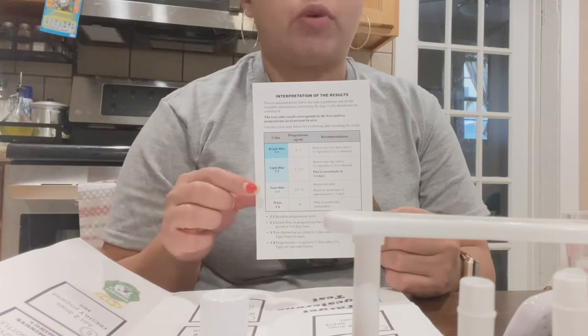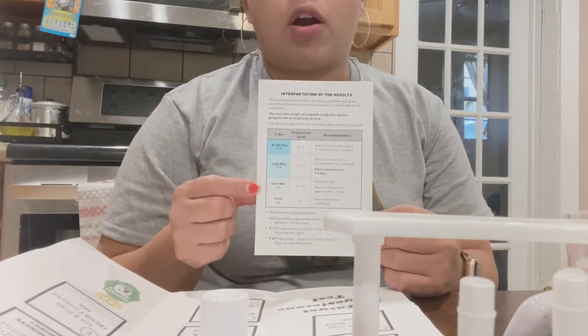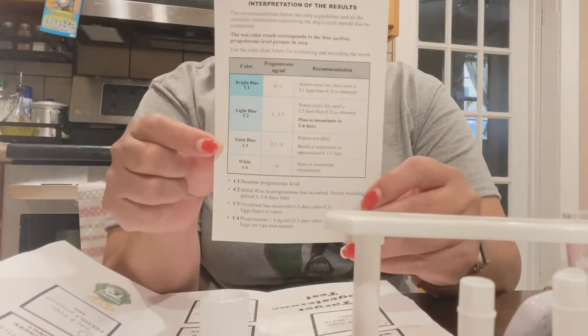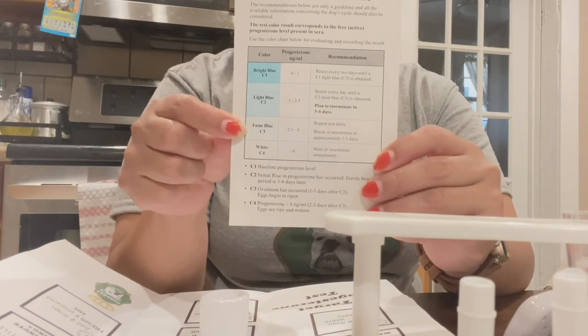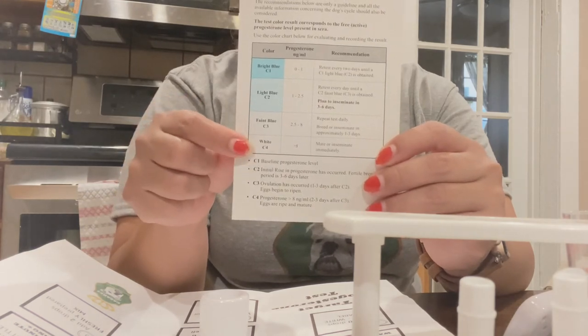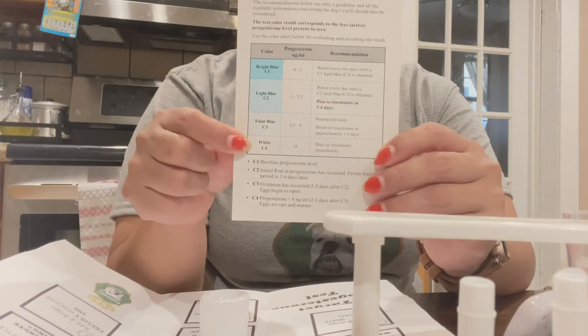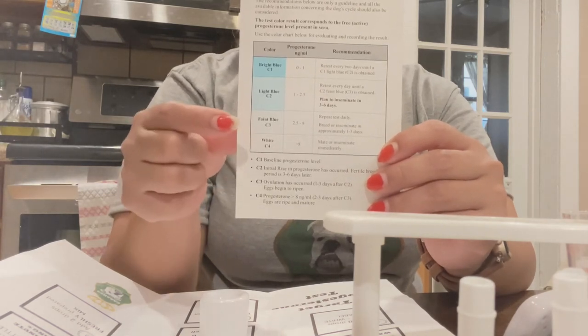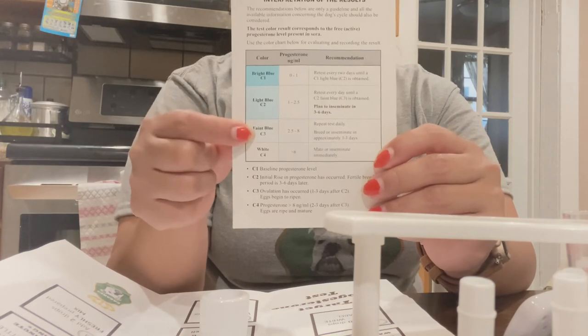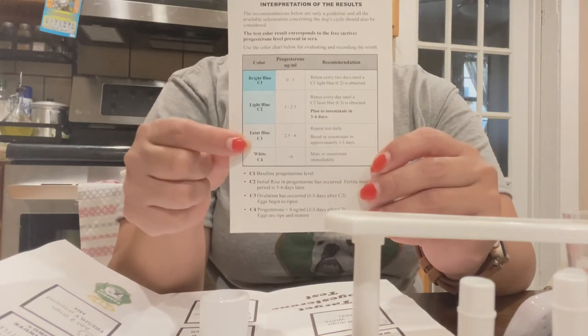Just to recap: I inseminate when they are on faint blue, then retest. If they're on white, inseminate again in two days and retest again. If they are still on white or faint blue, I go ahead and inseminate again. Sometimes their ovulation period is too short — from white they can go the next time I test back to bright blue, so I want to inseminate again during that window.